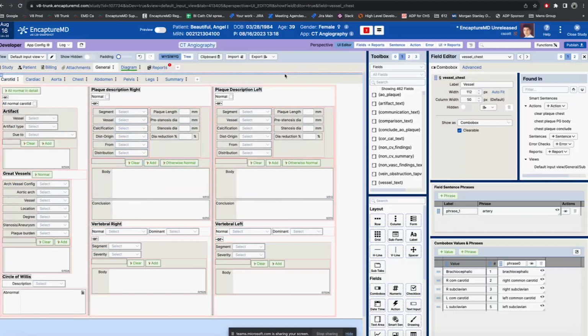And so that's the ability to add or change any of these applications to conform to your standard workflow is possible. That being said, I think what you're going to find is that we're really close right out of the box, unlike a lot of systems where they'll tell you, oh yeah, like your EMR will say, yeah, we can build that for you. And what that means is like 6 months to a year of work to get it to be exactly the way you want it. Whereas with us, it's like, after the first couple of weeks and you've gotten to use it for a while, you're going to say, hey, we need to change this and that, and then it's done. So a lot less effort than, quote, we'll build it for you. So yeah, closing this.